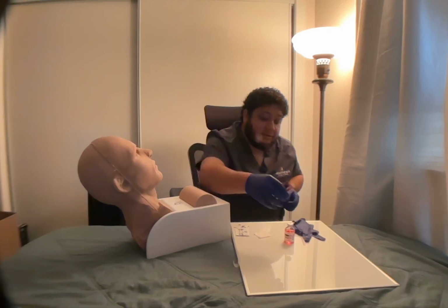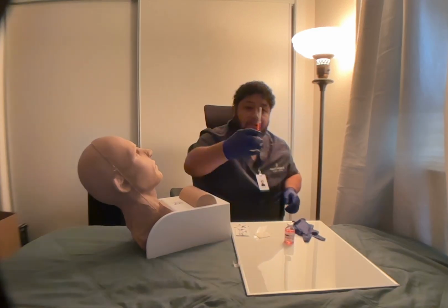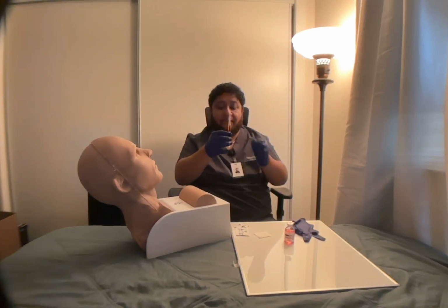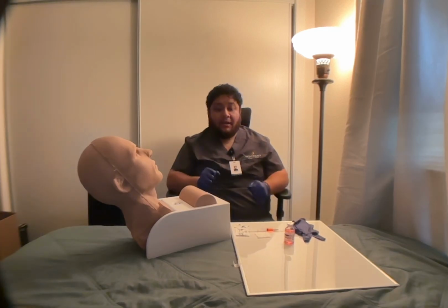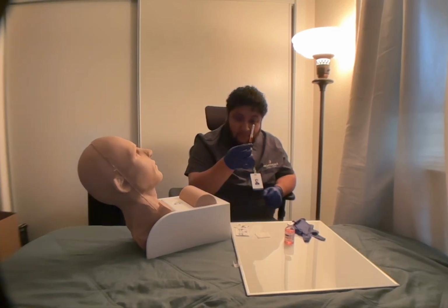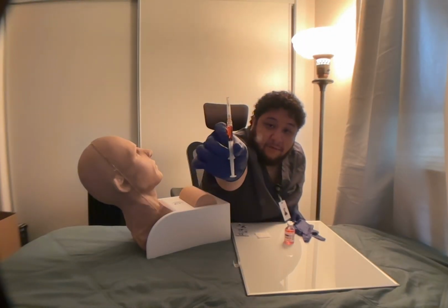And I'm going to use the scoop method to apply the cap back onto the needle, like so. Close the needle, close the cap, lay down my syringe here. Oh, sorry, and just to verify that it's 1.5 milliliters, I will show the camera, like so. Okay.